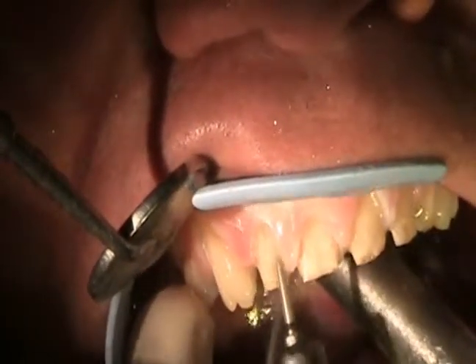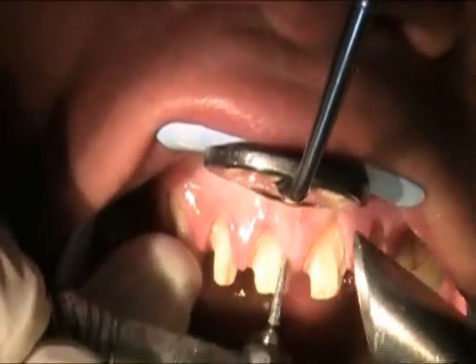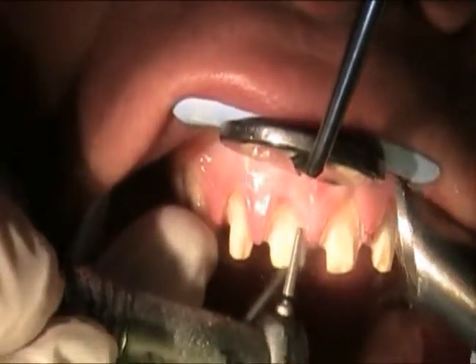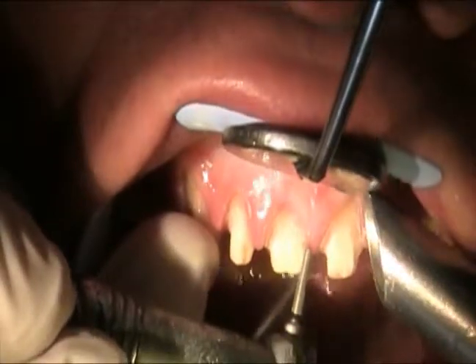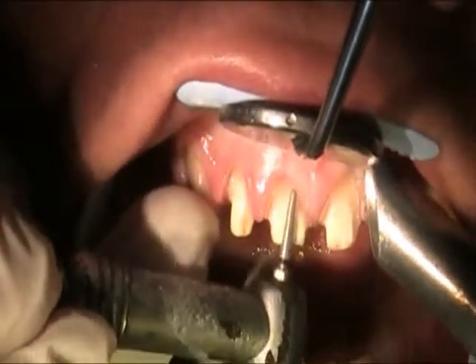So we continue to go down the line. We've got six teeth that we need to do. We'll go and refine each preparation, make sure every single tooth is perfectly done before we consider taking any kind of impression of that.